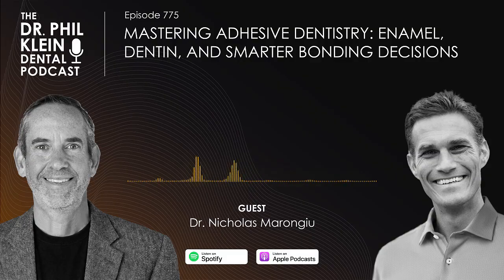You've got to be careful and you've got to move quickly, because once you cure that Scotchbond Universal Plus adhesive on the tooth on your preparation, as soon as you load the restoration, you start to see that resin, even though it's got like a 3 or 4 minute working time on the dual cure component, you've already cured the adhesive resin on one side. You've got the uncured but mixed resin on the other. As soon as that resin touches that surface, it starts to polymerize. So you've got to seat your restorations quickly and start cleaning up. But that's another technique where you can ensure that you're getting full cure because you've already polymerized that adhesive layer underneath everything.